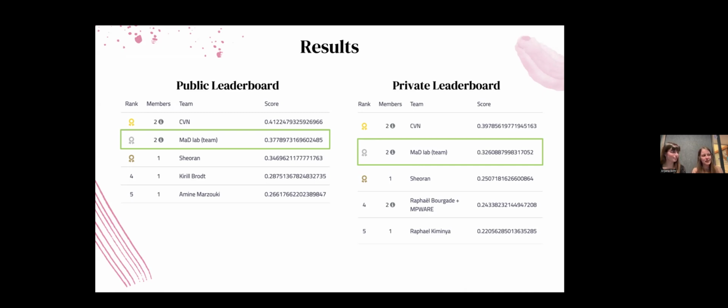What happened also is that they didn't have to annotate every single lesion. They only had to annotate some of the lesions in each slide, and we didn't know this before doing the challenge, so we didn't take it into account when doing our methods.